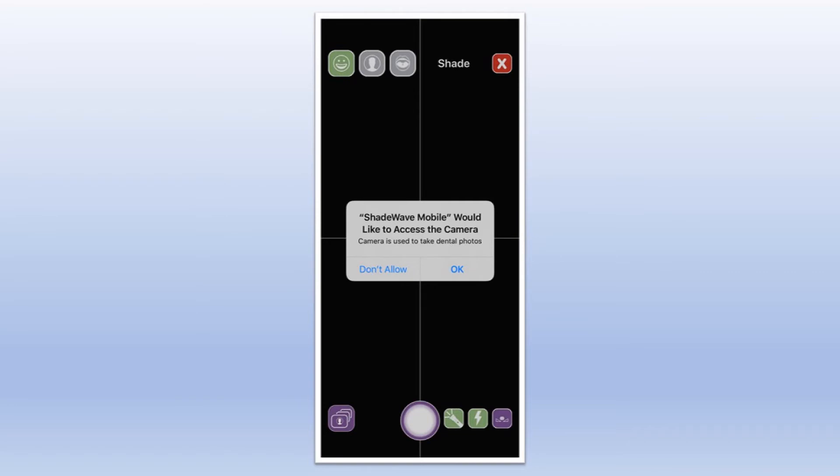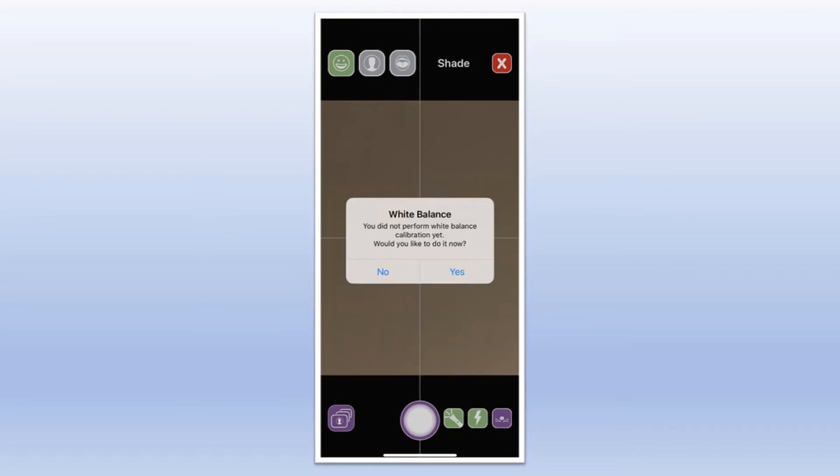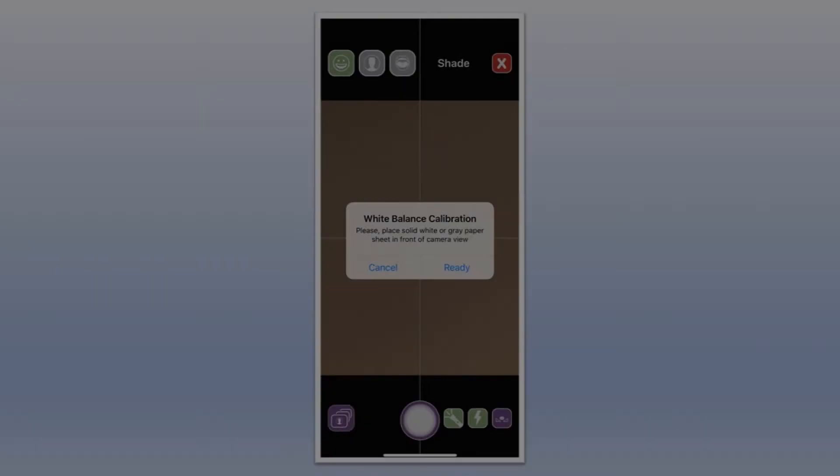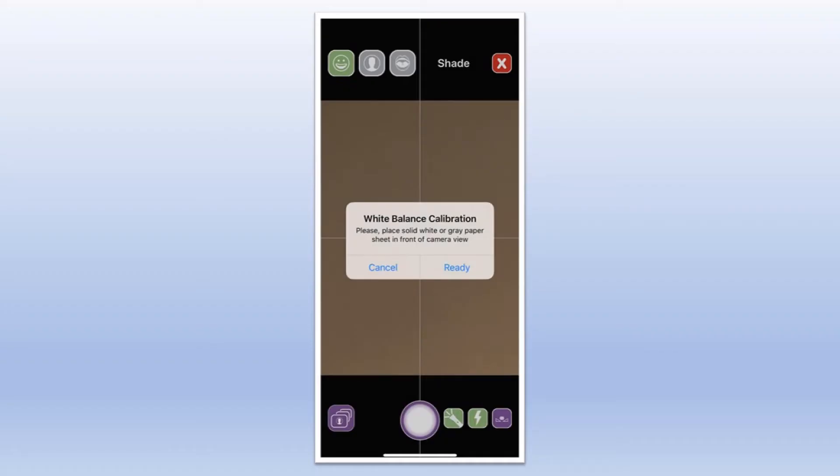You should be live now. Next, allow ShadeWave to access your camera, and finally say yes to white balance and follow the procedure.